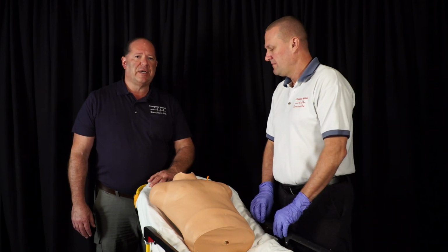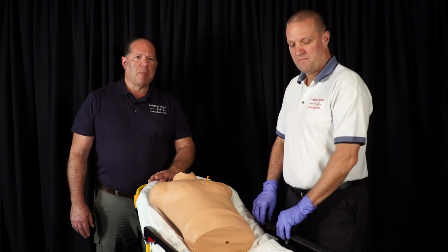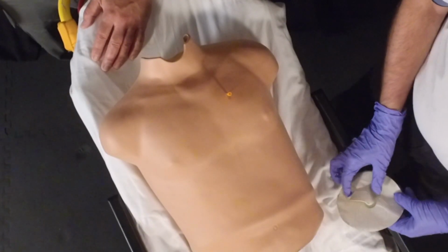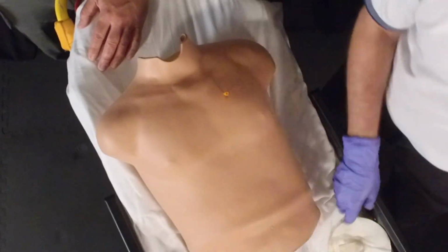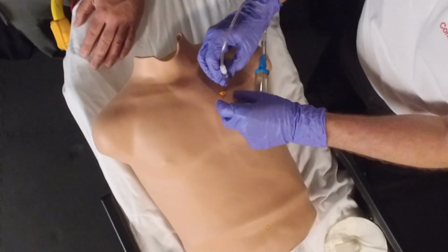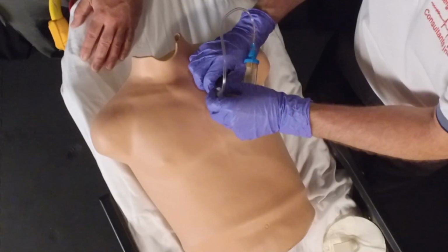You now have created a one-way valve for air to come out. A small amount of air could enter. Some services will use a commercially prepared one-way valve of some sort. However, just getting the hole in the chest is the life-saving procedure. Do whatever you do in your system.